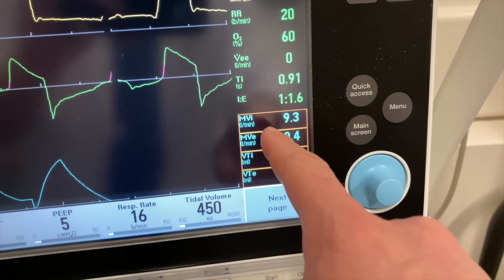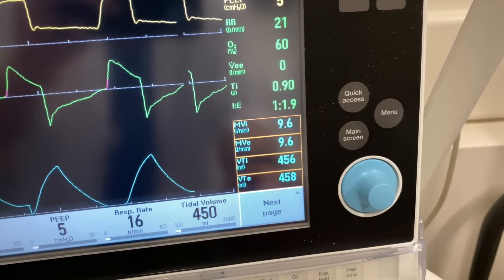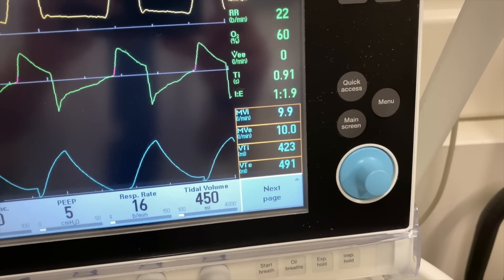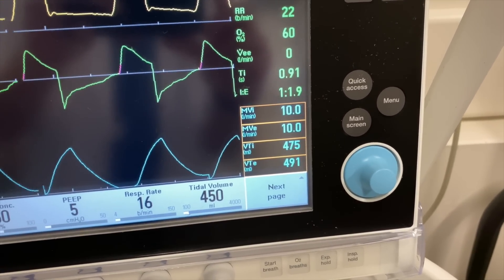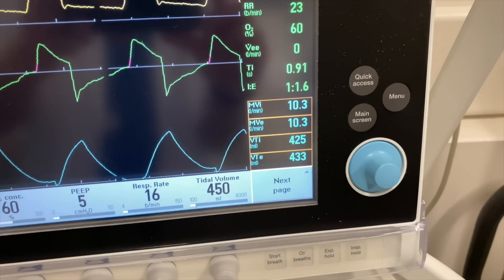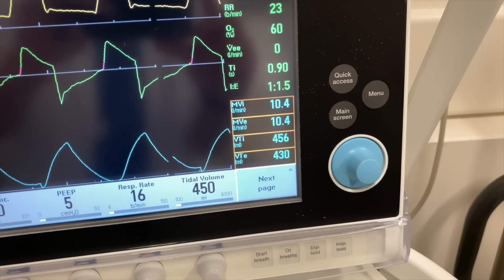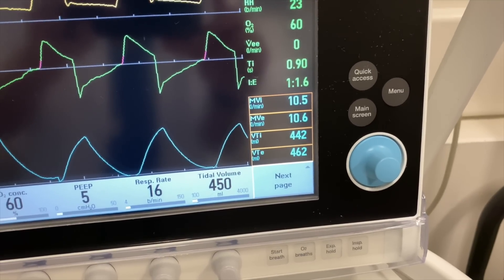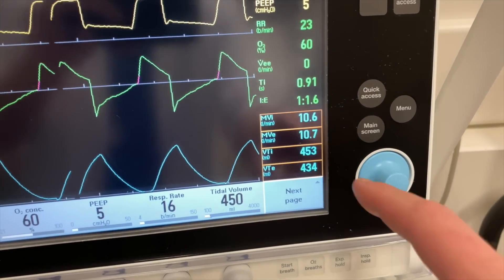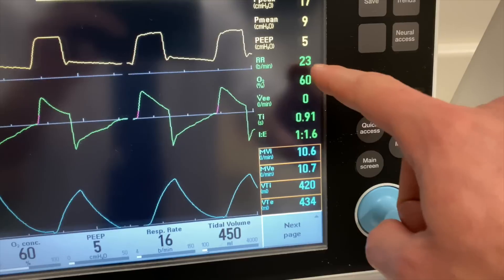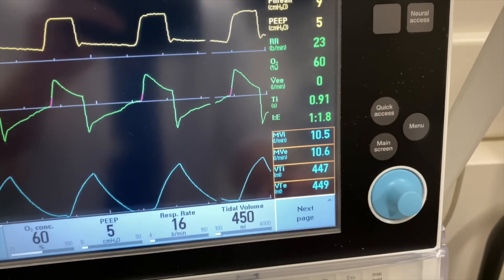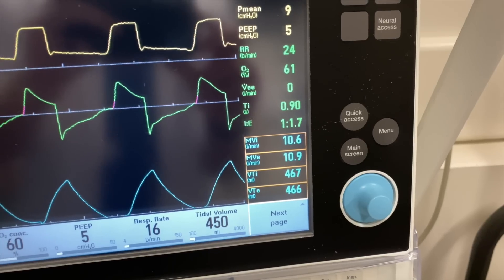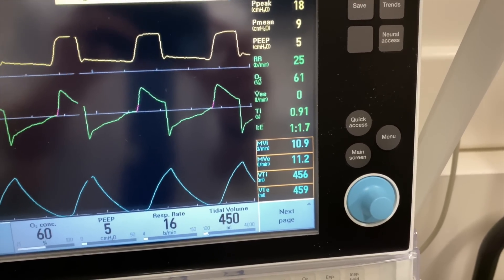Here's your I to E ratio. And then your minute ventilation — inhaled and exhaled — those numbers generally speaking should be between five to eight. That lets you know the patient is where they need to be with regards to their minute ventilation. Minute ventilation is actually the respiratory rate times the tidal volume, just in case you need to know that equation.